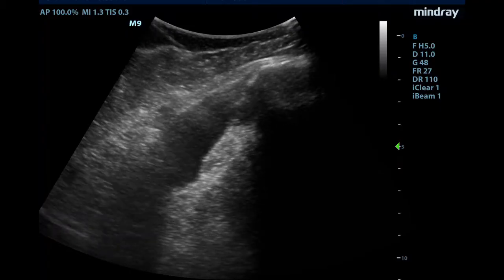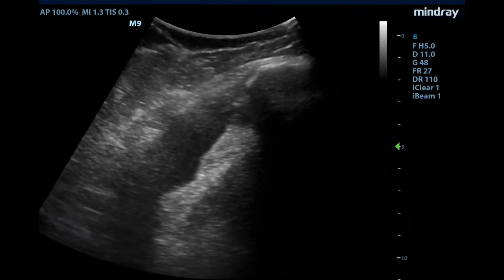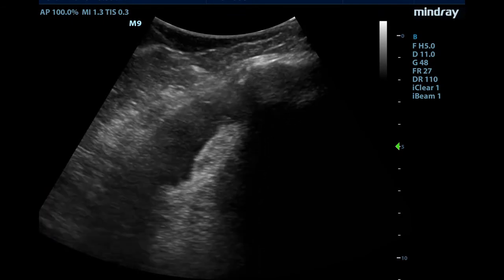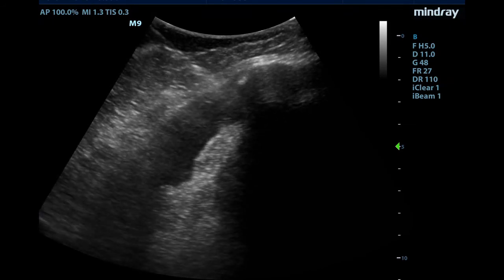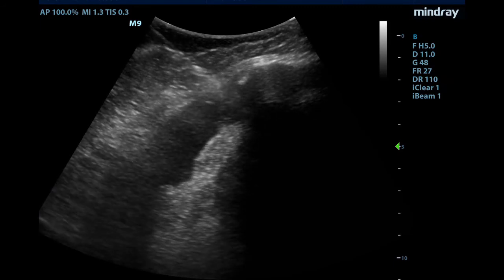This patient was so large that I actually could not visualize anything with the linear probe. You can tell by the footprint at the top of the screen that I had to use the curvilinear probe. We again see a large hypoechoic or black fluid collection near the knee. Different from the first patient, I performed this arthrocentesis in a long axis view as you now see the needle entering the screen from the left side going into the fluid pocket.